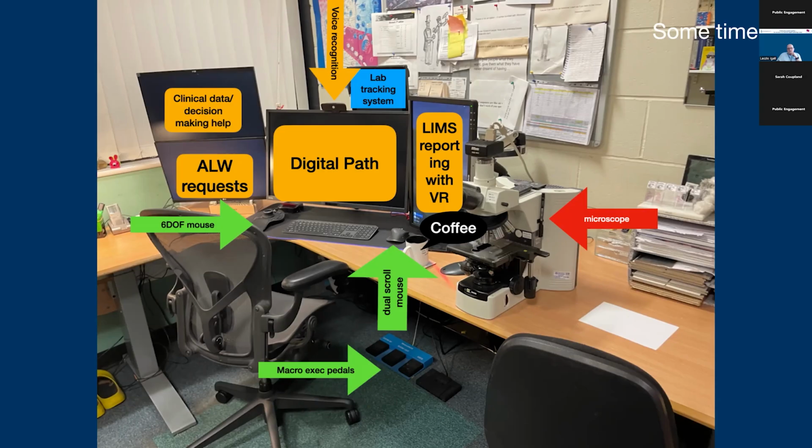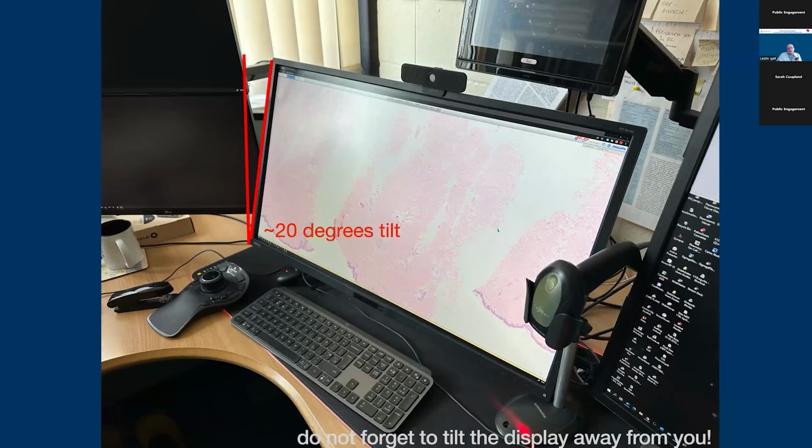I also procured some pedals from a macro workstation, but now I've done slightly away with this one, to initiate some macros and or switching off the microphone. Yes, I still have a microscope, and the most important element is the coffee there. Ergonomic things to make your life slightly easier.